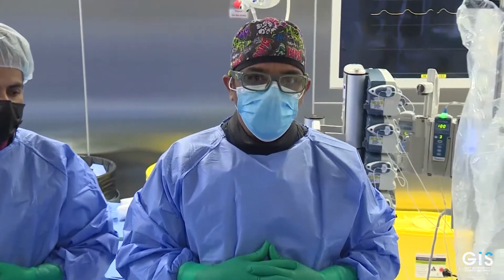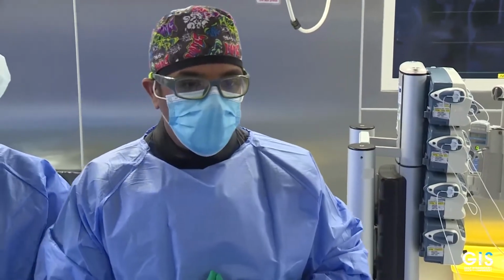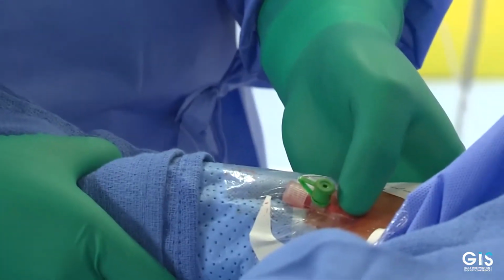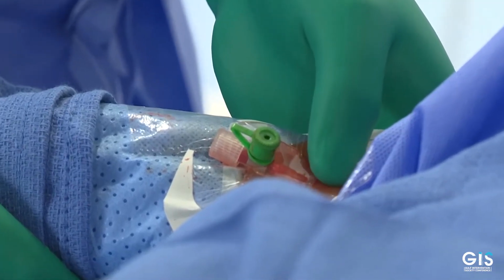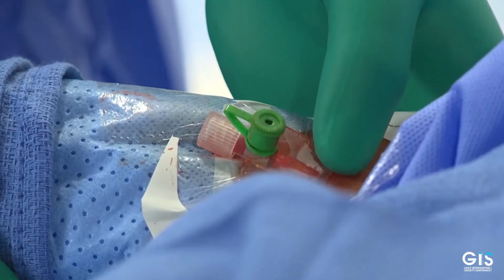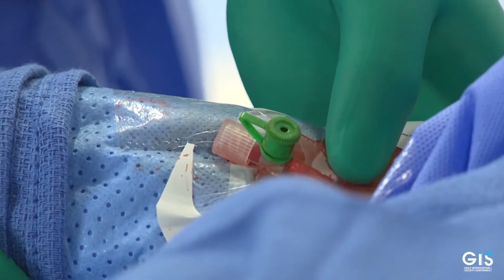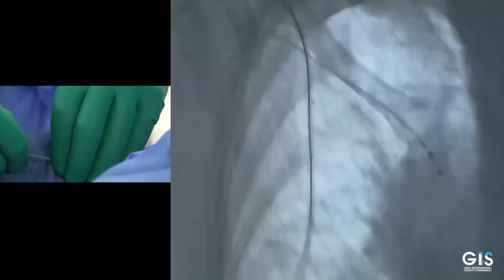The first aspect of this case, I would like to show you a different alternative approach for doing a transvenous pacemaker. This will be through the basilic vein through the antecubital fossa. You start basically by establishing an 18-gauge IV cannula in the antecubital vein, and then exchange it to a regular 6 French radial sheath, and through it you could advance your 5 French pacemaker. So this is what we're going to be showing you right now. As you can see, you can take it all the way there, and then if you face resistance, balloon up. Yes, balloon up. It's up.